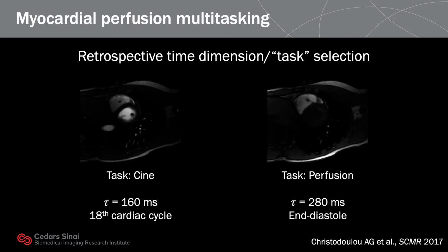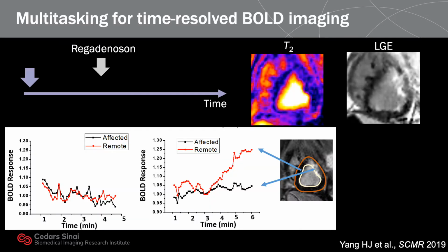We can treat dynamic contrast enhancement as a time dimension to quantify first-pass myocardial perfusion. Contrast concentration is estimated by direct T1 mapping, overcoming the blood signal nonlinearity issue associated with conventional perfusion MRI. This is the work by Randy Young from Cedars.